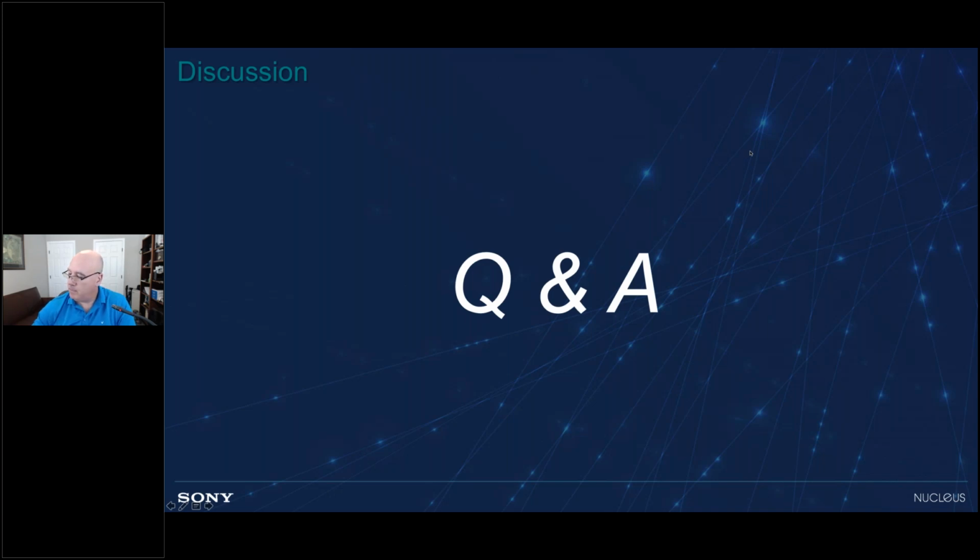Okay, we've got a couple of questions coming in here about streaming to a tablet. So, asking, can the video stream be viewed on a tablet? Yes. The short answer, I guess, is that we're using an iPad right now. There's a free app that you can download and use on your iPad for viewing directly from the ORs. So it is possible, and it's actually in use in a couple of places right now.